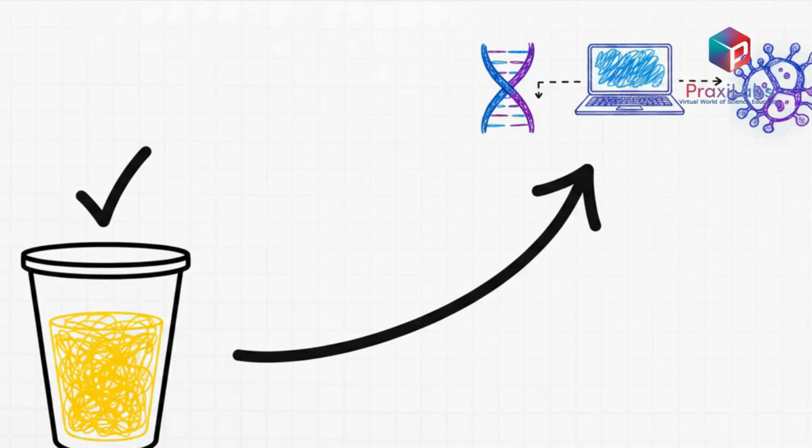Now here's a kind of surprising real-world fact to pull this all together. Do you know what the most common toxicology test actually is out there in the real world? It's the urine toxicology screening test. Why? Because it's quick, non-invasive, and highly cost-effective. Physical labs often have to rely on simple tests like this just because of tight budgets and safety constraints.